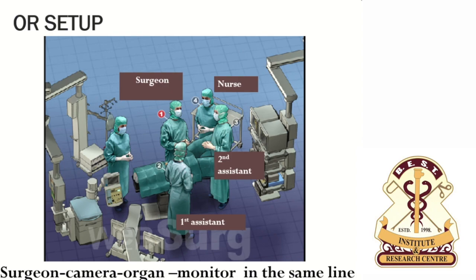See, generally laparoscopic surgeries tend to take longer time compared to open surgeries. As time advances and as your experience increases and as your approach to each and every case improves, the duration of surgery actually reduces as compared to open surgery. With more and more confidence and use of better equipment, you can do a hysterectomy in 15 to 20 minutes.